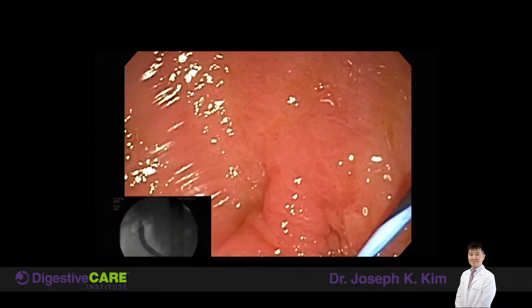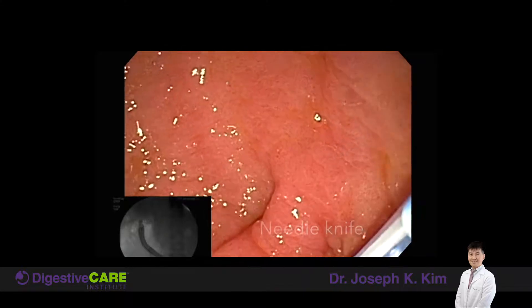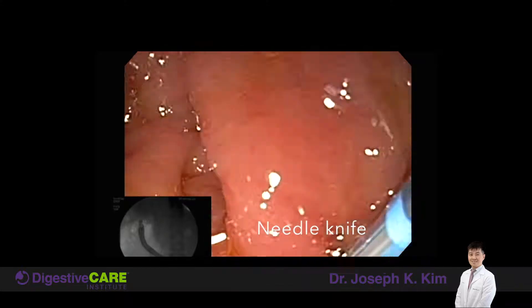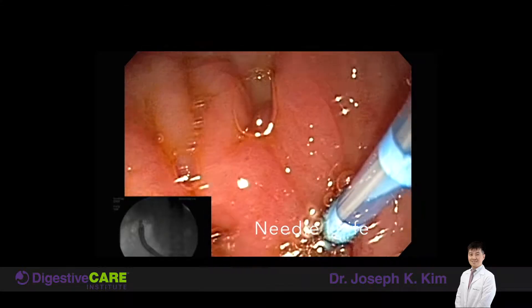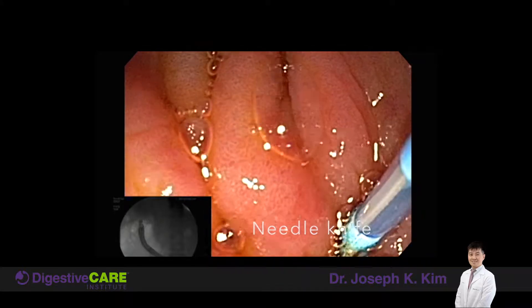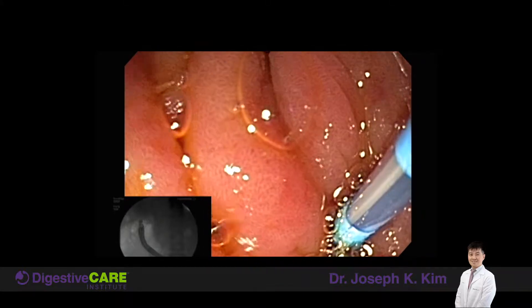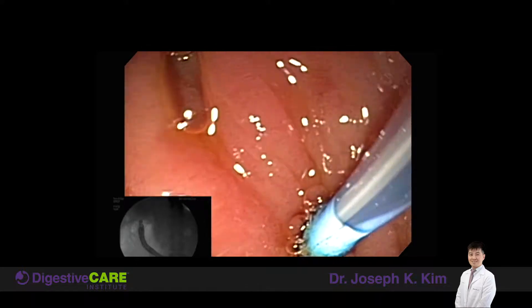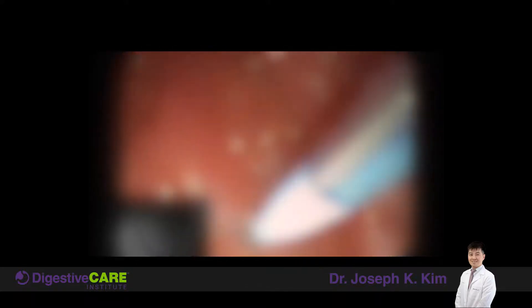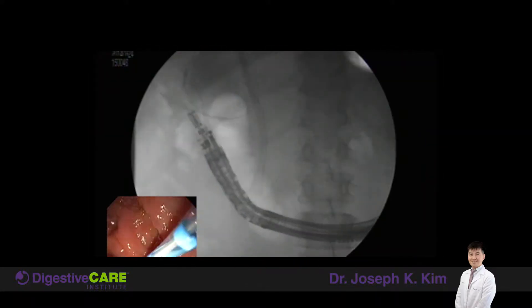On the endoscopic view, we see the wire that's going through the stomach wall into the biloma, and I'm using a needle knife to cut a hole from the stomach into this biloma.